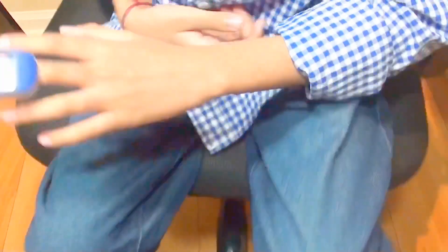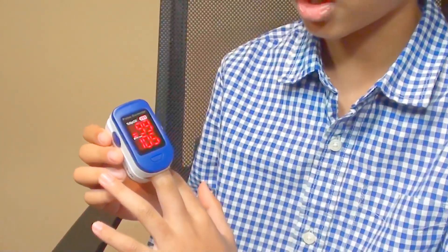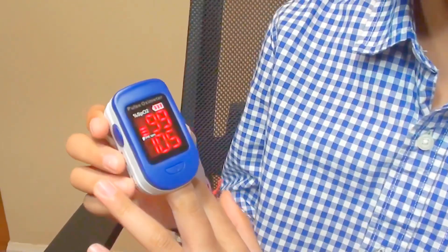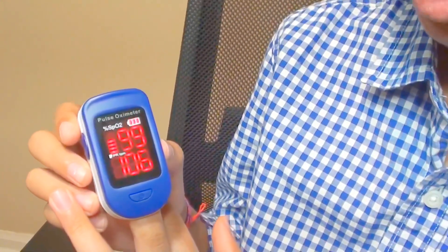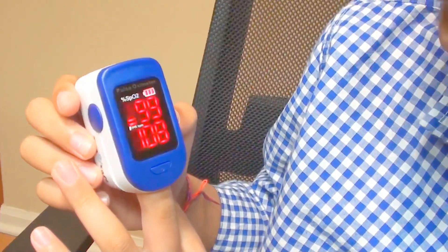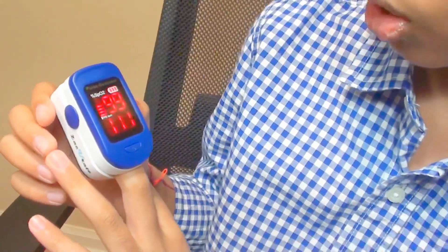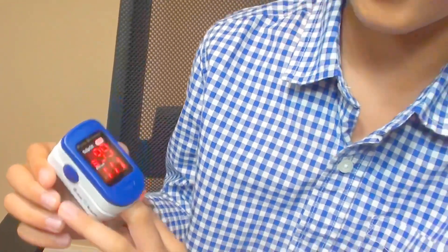See? The above one is your oxygen saturation, and the one below is your pulse rate. My oxygen saturation is 99 and my pulse rate is 108. The normal range is 95 to 100. If it's below, then immediately go to the hospital.